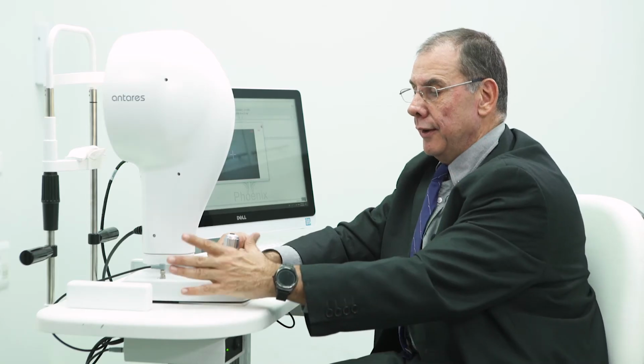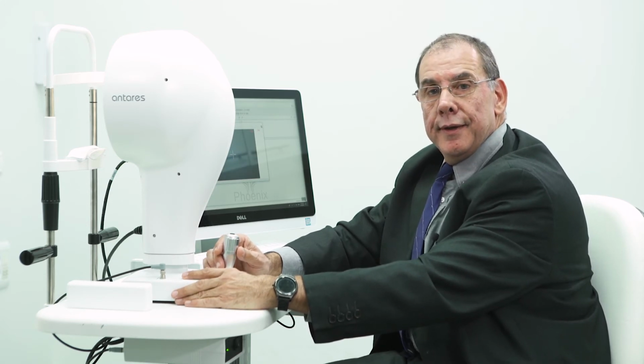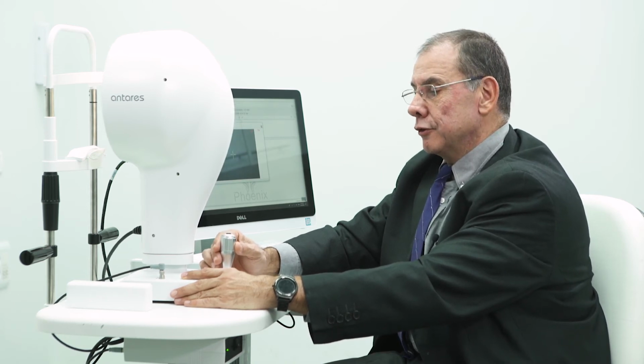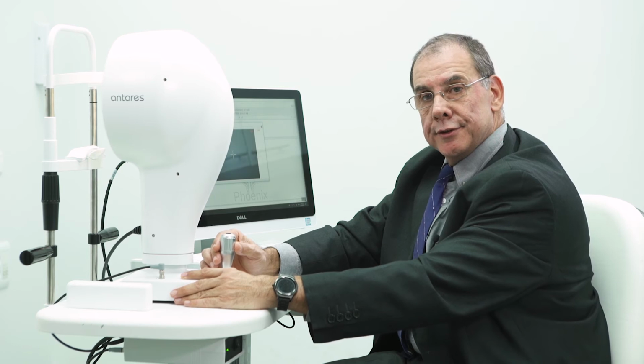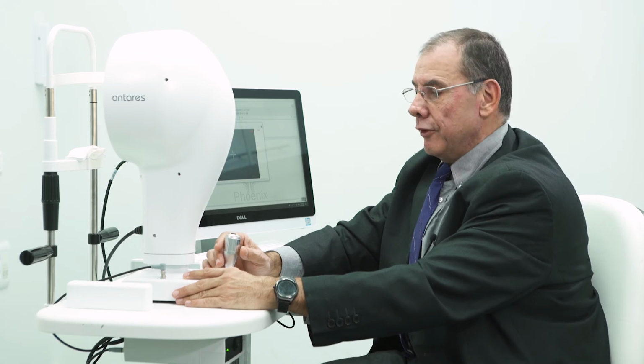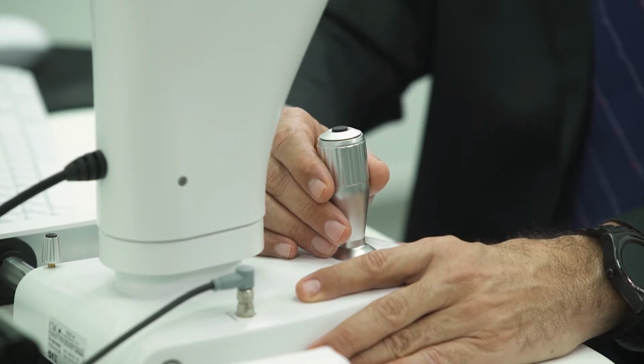If you look, I use one hand over here, which is used as a stabilizer, and the other hand is on the joystick. I always try to have the joystick as straight as possible, as this gives us a straight trajectory. We won't do any slaloming. We're not on the ski slopes at the moment. So what we'll do is go from slightly out of focus, into focus, and then out of focus again.